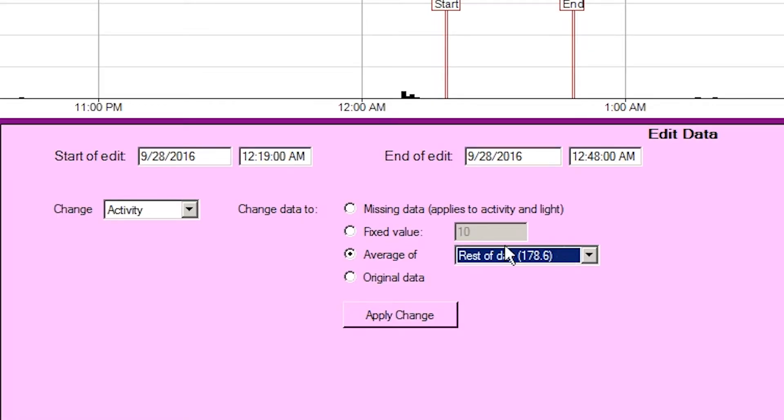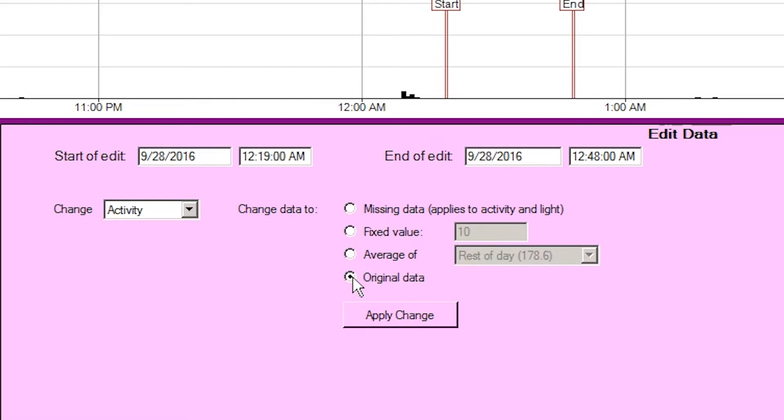Original data, because all of the data and changes are contained as an audit log within the motion file, this option allows you to restore the original values first recorded before any edit took place.